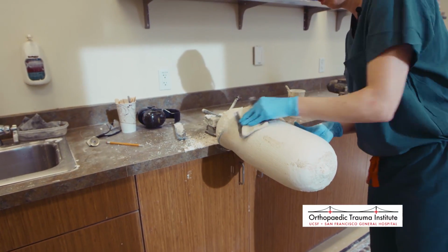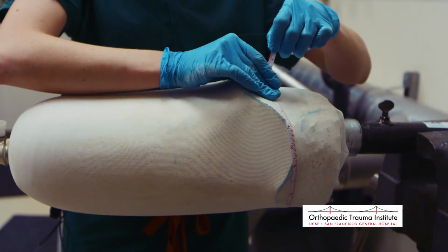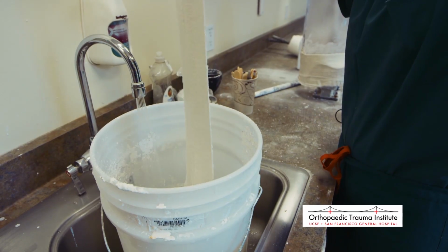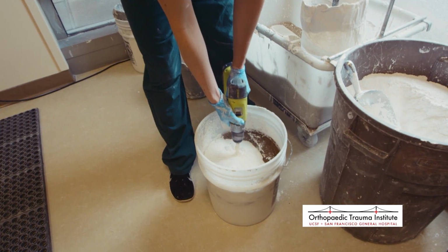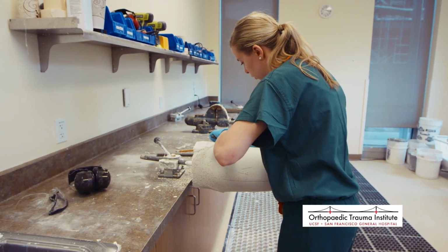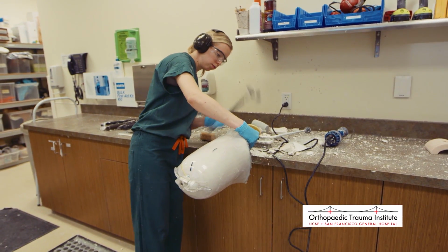Here at the Orthotics and Prosthetics workshops at the UCSF Medical Center, the quest to help amputees regain their mobility and independence begins in earnest. The crafting of a prosthetic limb is a collaborative process that will involve both the patient and the person who will make the limb, also called the prosthetist. Here is UCSF Medical Center prosthetist and orthotist Hannah Dollard explaining the process.